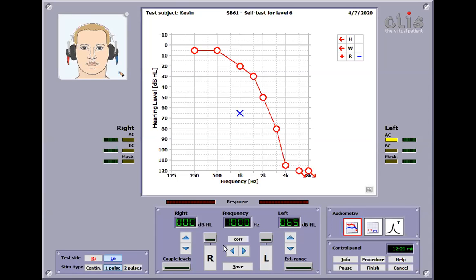So in a clinic setting, you probably wouldn't want to smash your key so loudly. The patient would probably hear that first instead of the signal. But I would say Kevin is pretty deaf, so I'll smash it as loud as I want. Again, I blame coronavirus.